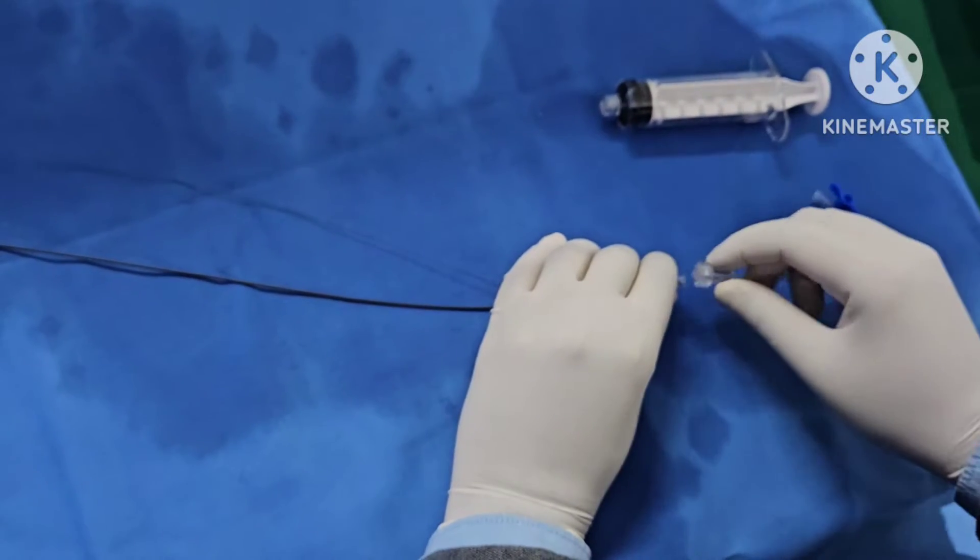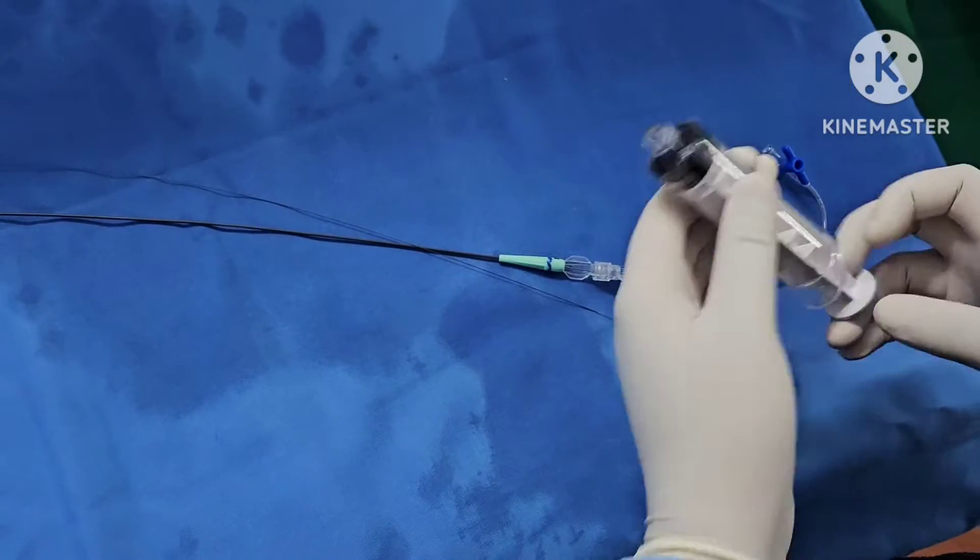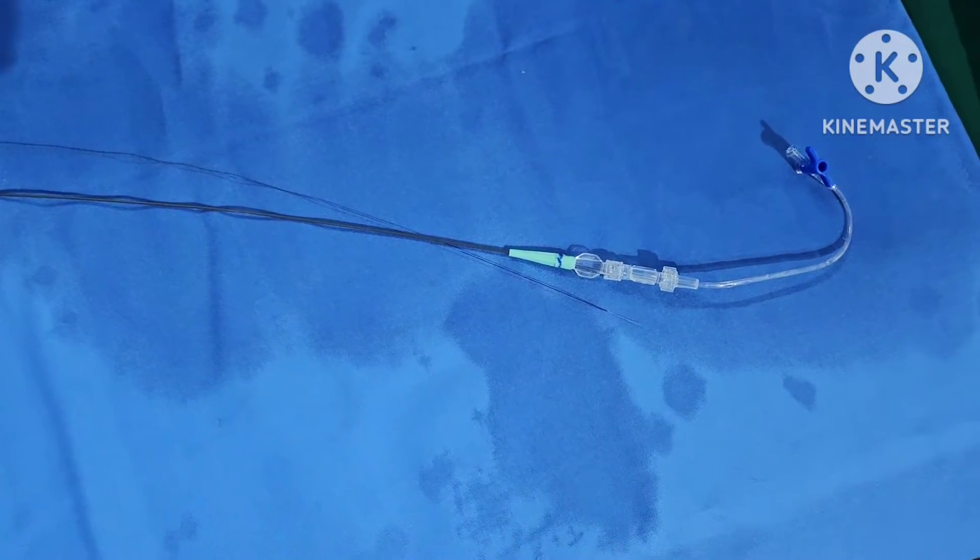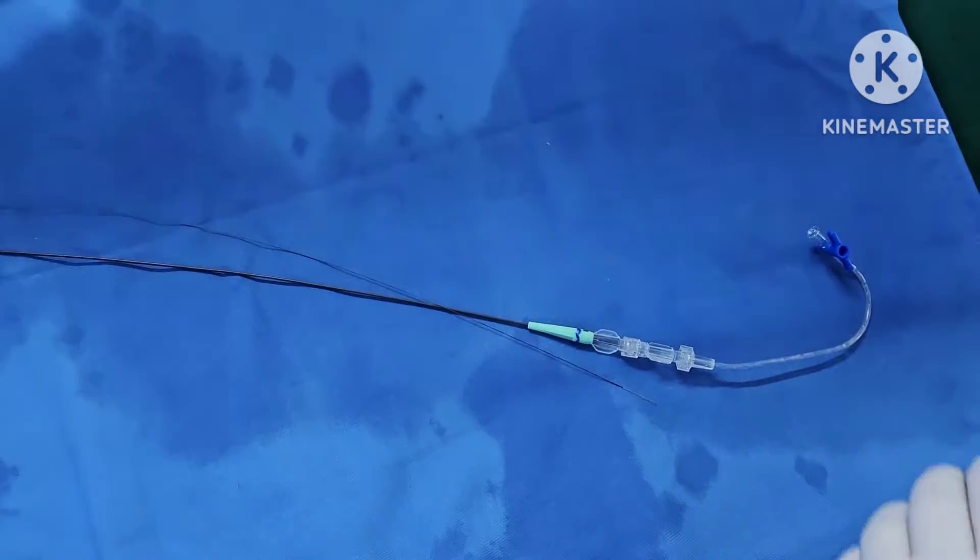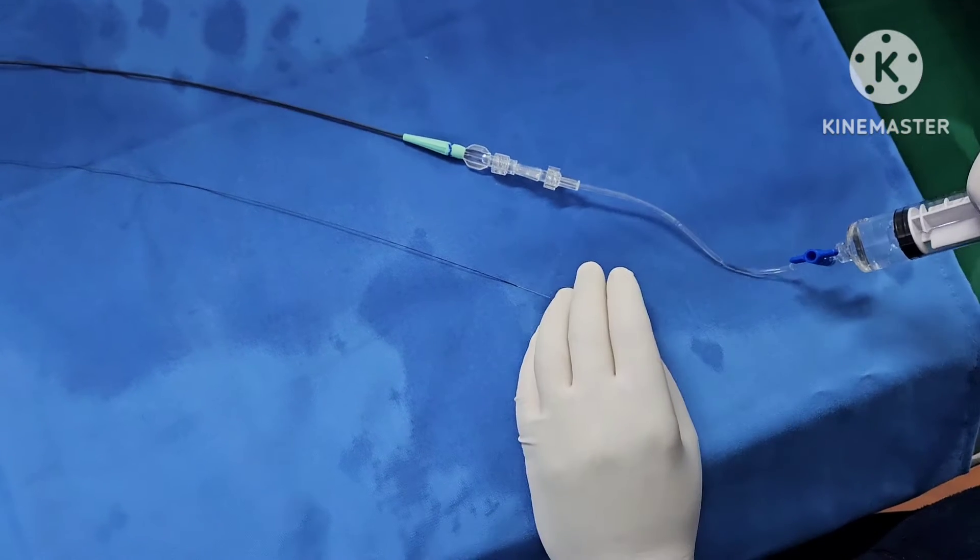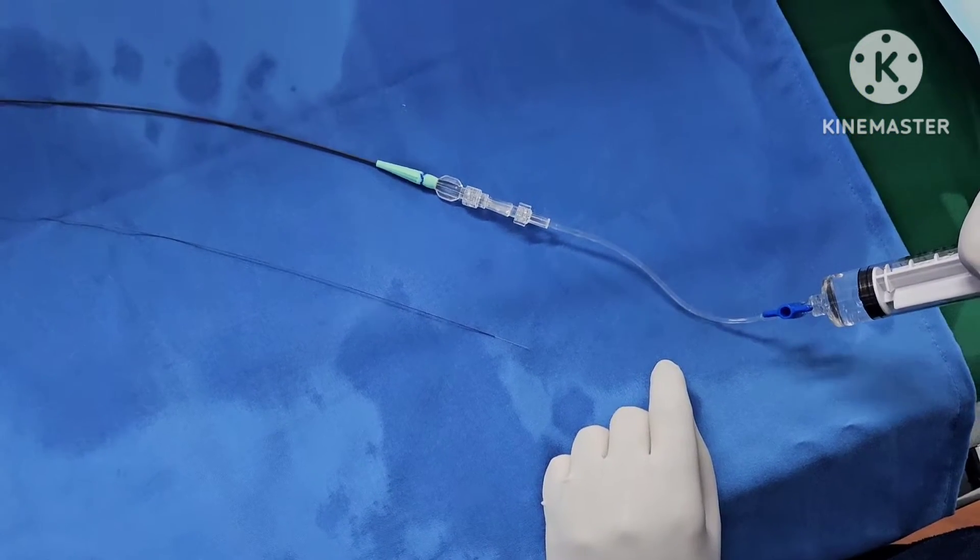Next, we will put the stopcock and we will take a little more of saline.